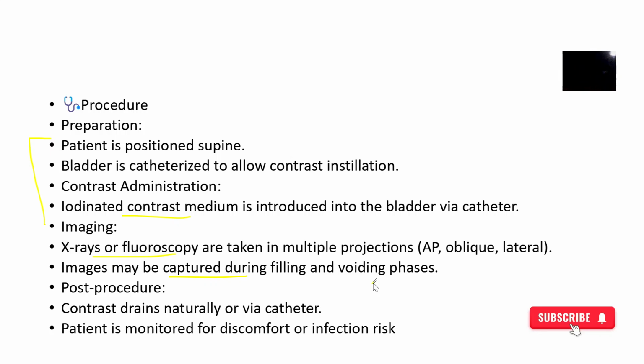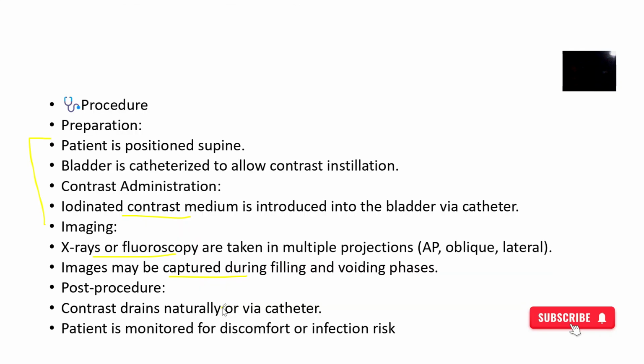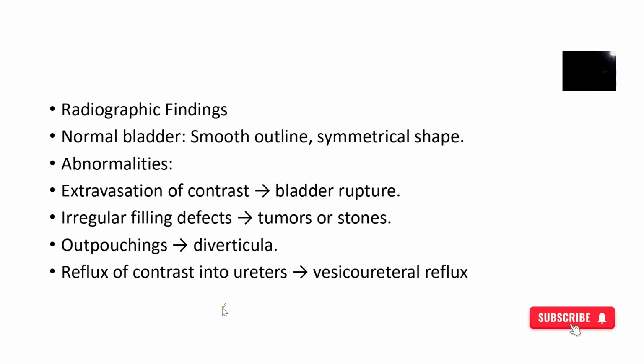Do you understand? So after the procedure, you also make sure that all the contrast that was put into the bladder is drained out, okay, and the patient is monitored for any discomfort that might come up.